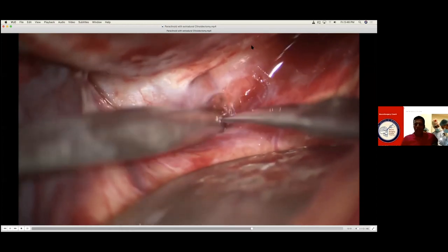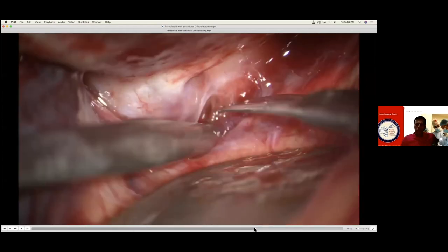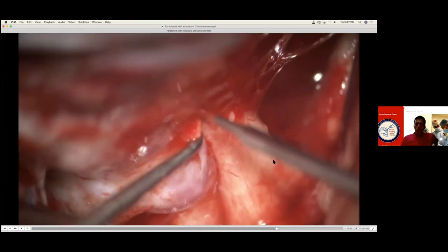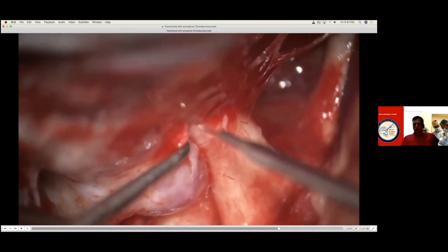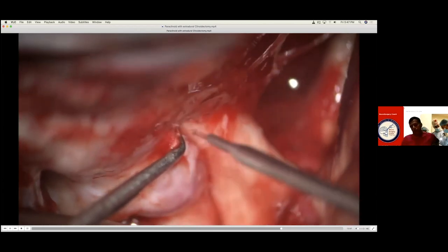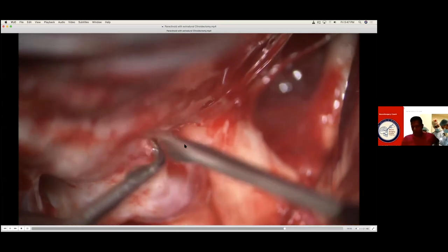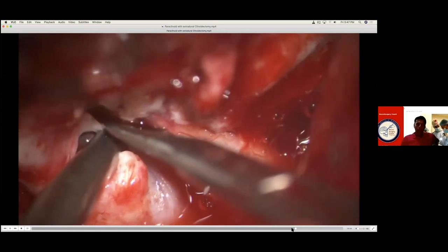Keep on drilling the entire clinoid away — that is your main part of the surgery. Once you do that, that's an optic nerve, that is the aneurysm, that was the clinoid which you took off — it is directly in touch with the aneurysm. Now it's easy. That's the optic nerve. That's a falciform ligament, that is a distal dural ring. All can be beautifully exposed because the clinoid is out. You can see that is only a fold — you can easily cut here. I'm going to put in a hook into the falciform ligament along the optic nerve and cut this away. Then I have the aneurysm. This is a transitional aneurysm, and when I cut laterally I'm going into the cavernous sinus roof — the C3 carotid.